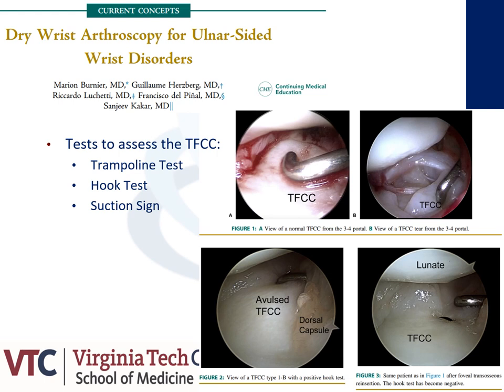The TFCC is a critical anatomic feature of the ulnar aspect of the wrist, and it is imperative to know how to inspect it during arthroscopy. Three tests are discussed. The trampoline test is performed utilizing a probe placing pressure along the central aspect of the TFCC: if intact, the TFCC should become spontaneously taut, but if there is a peripheral or foveal tear, the central portion will be soft and pliable. The hook test can be used to determine if there is a foveal detachment representing a Palmer 1B type lesion, performed by inserting a probe and applying traction on the TFCC from ulnar to radial, and is positive if the ulnar aspect is pulled radially and distally.